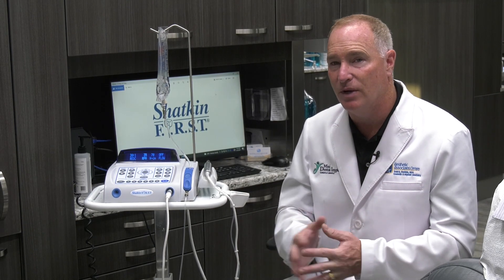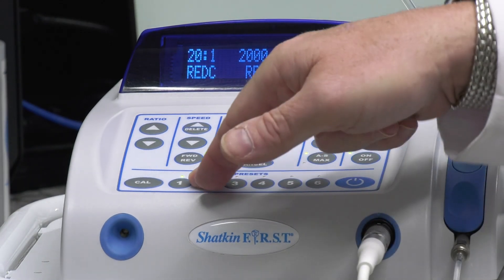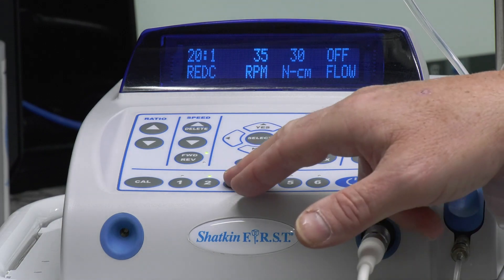Just to recap: you've got your pilot hole, you've got your torque test, and you've got your final placement of the implant.